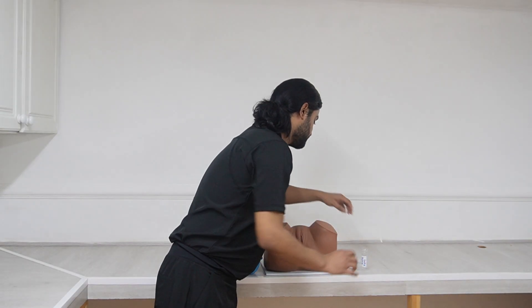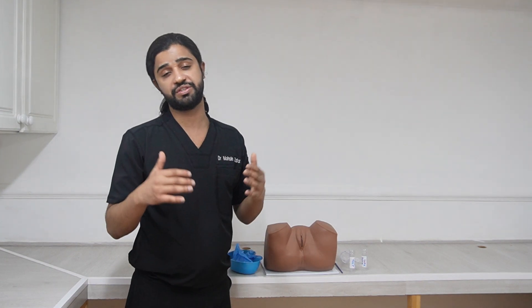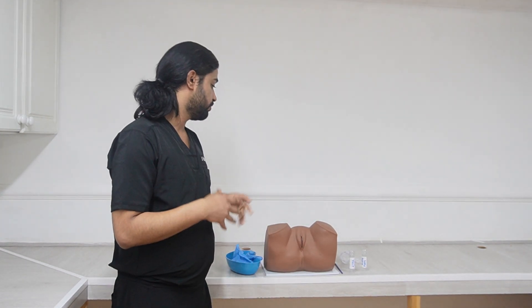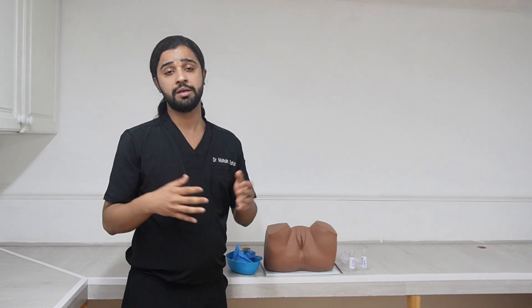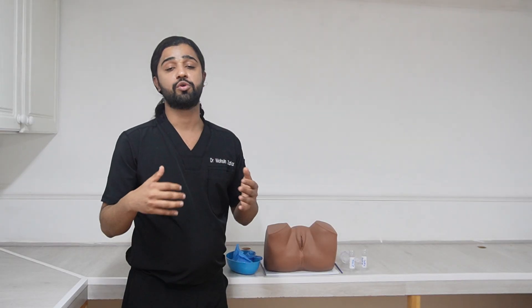Before starting the procedure we need to explain to the patient what we are going to do. We need to tell her: I am going to insert a lubricating instrument into your front passage — it might be a bit uncomfortable, but we will be using lubricating gel during this procedure to make it more comfortable.